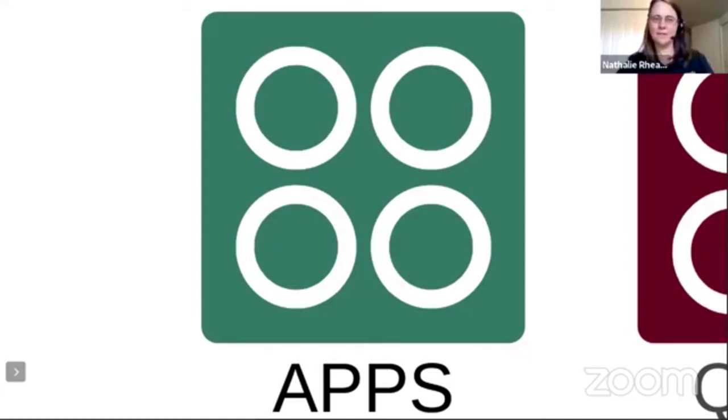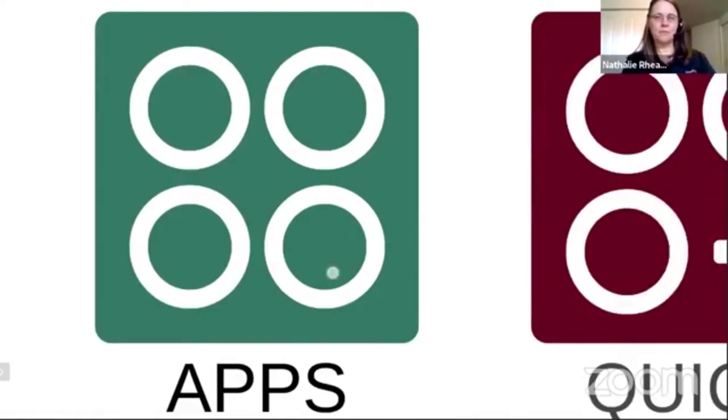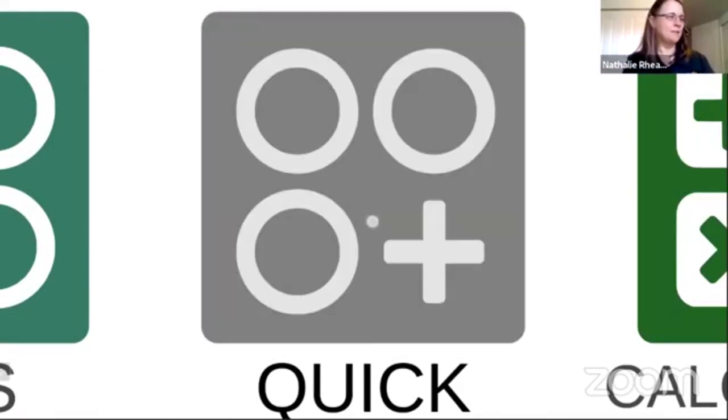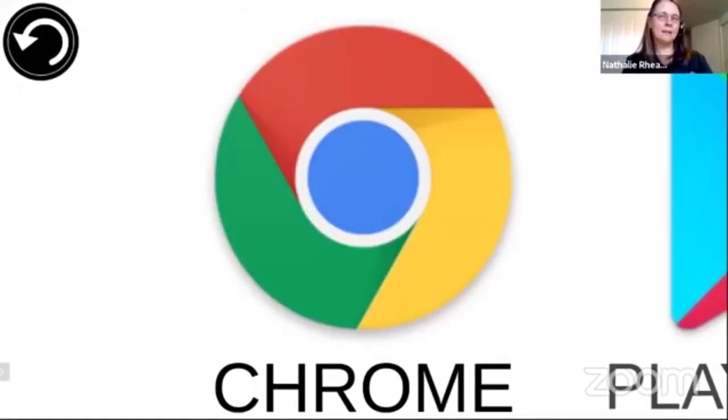Okay, very good. So I'm back, not muted, and this is my tablet. I showed you the app before. Now I'm going to show you the quick access. So I tap on it, and in that place, I can have hyperlinks of quick access that I'm going to be using frequently.